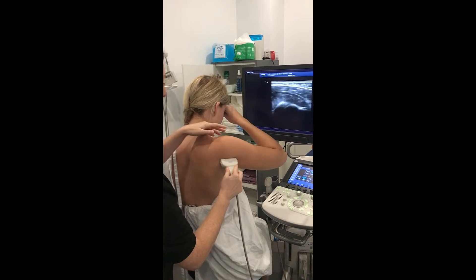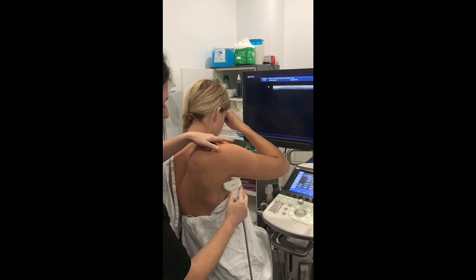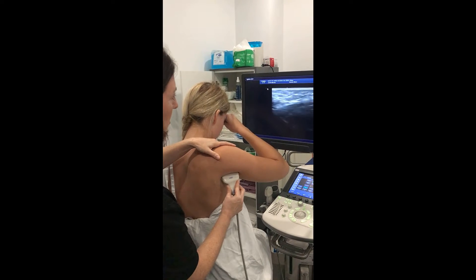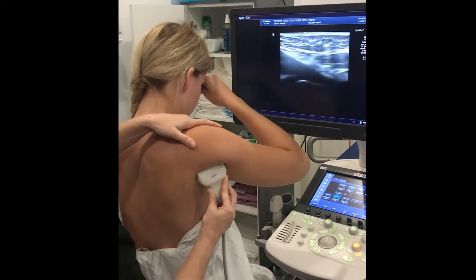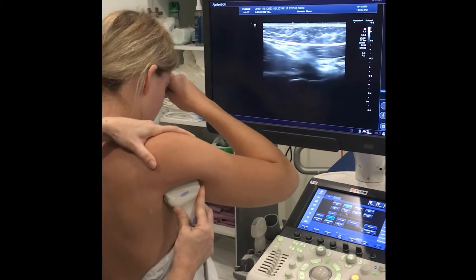From the posterior glenohumeral approach, we want to be a lot lower, so come down in line with that fold of skin and push the camera in. The first thing we generally see is the teres major muscle — it looks like a big hypoechoic triangle. So there's teres major.